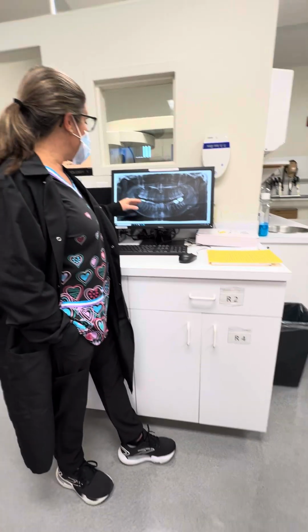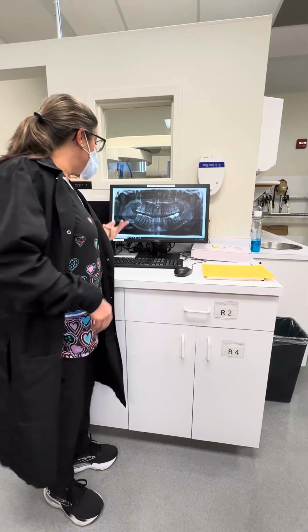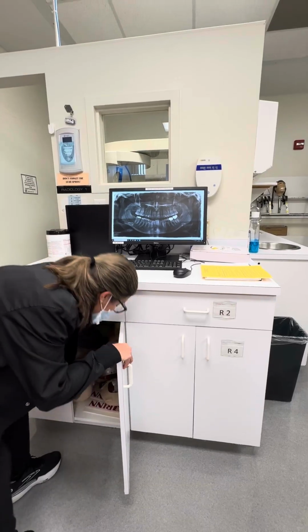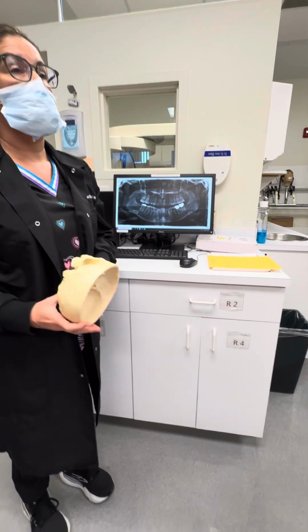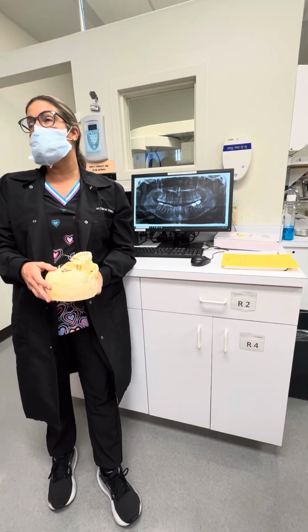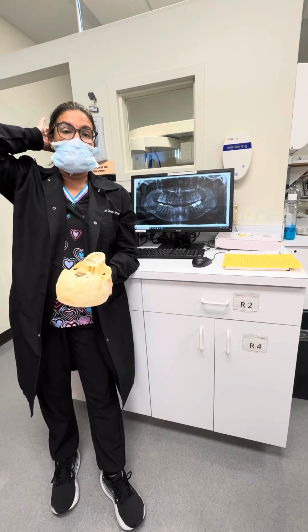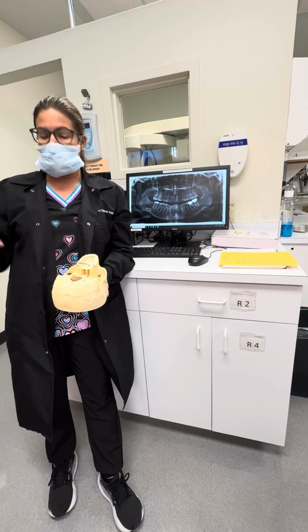So when you're giving these injections, depending on where you're working, you would also potentially need to give palatal injections. For you guys, you'd probably never need to give palatal injections just for scaling and root planing. You would have to give them if, say, the dentist was doing major restorative, like extractions or crowns or something like that.